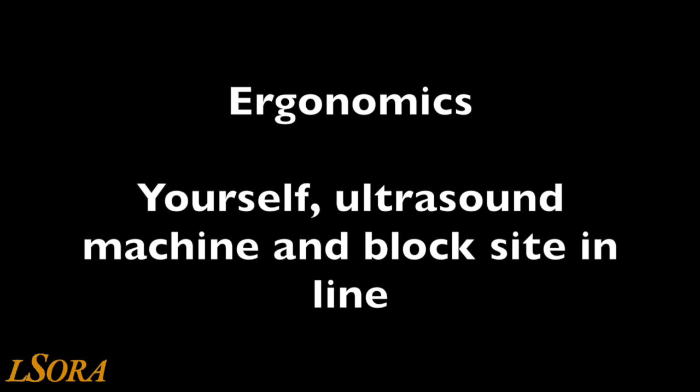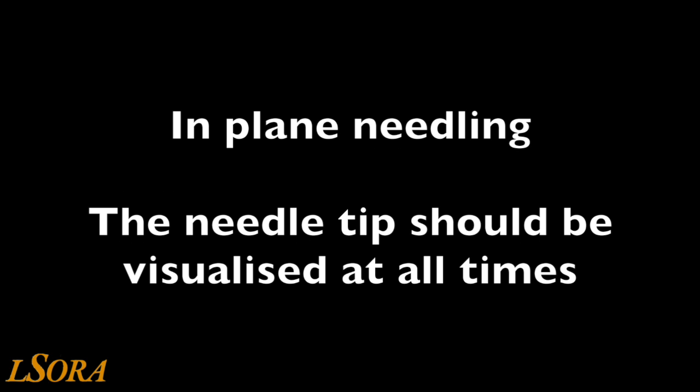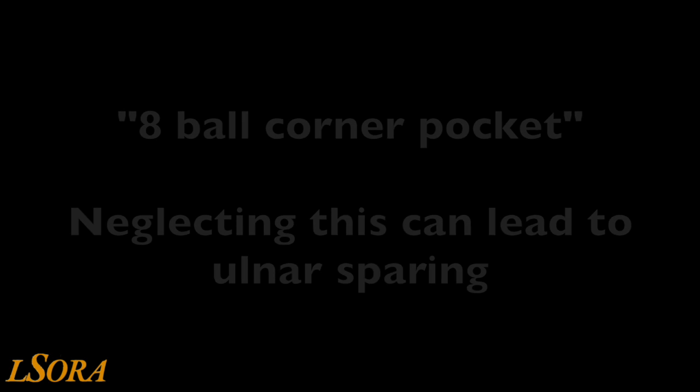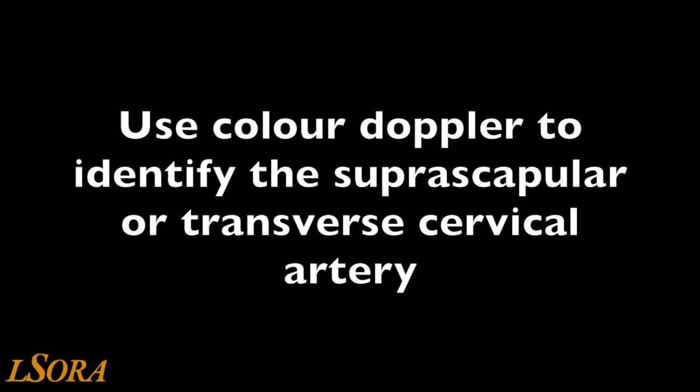Here are some tips. Have yourself, the ultrasound machine and the needle insertion point in line to optimise ergonomics. Have the patient sitting upright with the head turned to the contralateral position. Move the pillow to optimise your space for needling. We advocate in-plane needling so that the needle tip should be visualised at all times. Position the subclavian artery and the plexus on the first rib and not the pleura. Don't forget to deposit local anaesthetic in the eight ball corner pocket. Always inject in small incremental doses with the least amount of pressure possible and aspirate before each injection. Apply colour Doppler before scanning to identify the transverse cervical or suprascapular artery which may traverse the plexus.